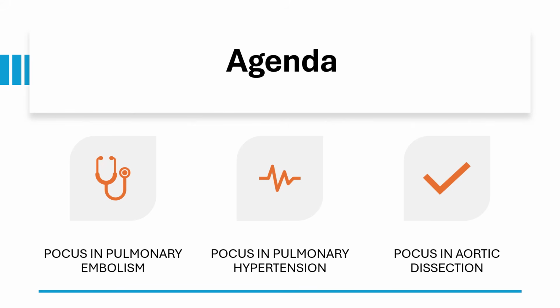The agenda for today is to review the use of point-of-care ultrasound in the workup and diagnosis of pulmonary embolism, the role of point-of-care ultrasound in pulmonary hypertension, and in aortic dissection.